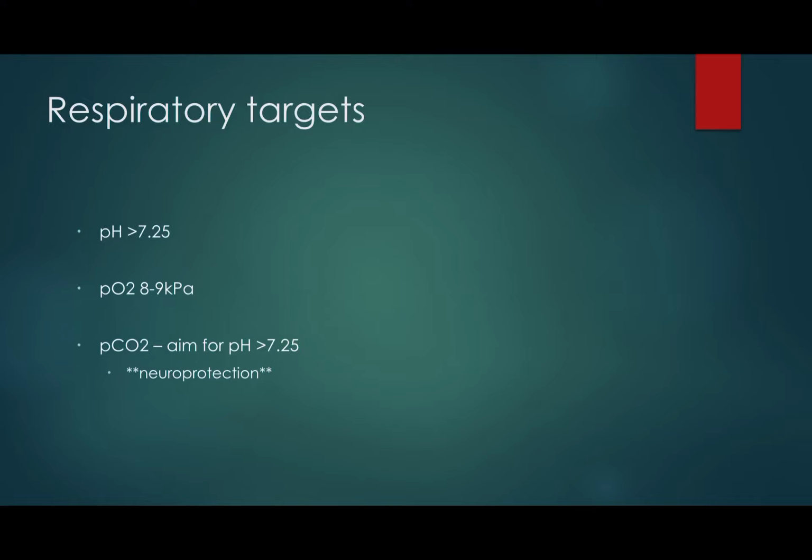Now, that's based on the proviso that that's providing appropriate amounts of oxygen for patients and they're not undergoing anaerobic respiration. So if their lactates are starting to rise, if they start to develop liver dysfunction or kidney dysfunction, or they start to show signs of ischemia on their ECG, we would revisit that. But for most people, 85%, even 88% is actually adequate. And if you measure your oxygen saturations when you're on a plane flying at high altitude, you will not uncommonly see patients with saturations of 88 to 85% and not feel anything of it.